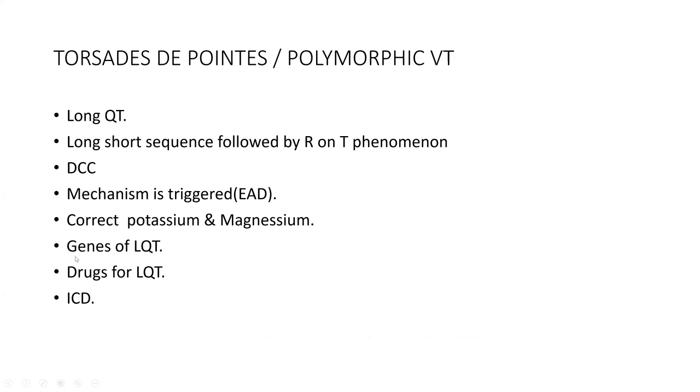They may ask you for the genes of the long QT: long QT1, long QT2, long QT3 genes, which we will discuss later on. They may ask you for the drugs responsible for the long QT and the drugs which are indicated in long QT. And secondly, they may ask you about the indication of ICD, which we have discussed already. Now moving on to the next ECG.